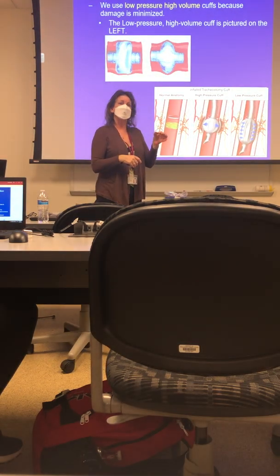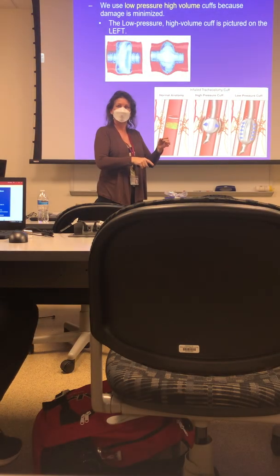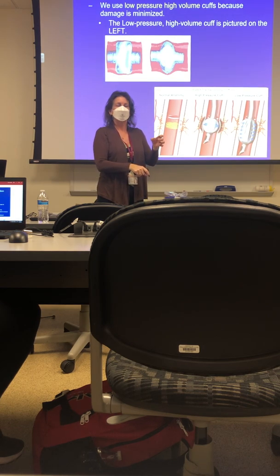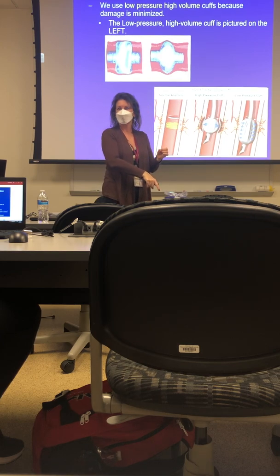If you don't have a good seal from the upper airway to the lower airway. Upper airway is not a sterile environment. Lower airway is a sterile environment. So if you don't have this cuff sealed, what can happen with the upper airway? Secretions can slide down into the lower airway, yes, they can.